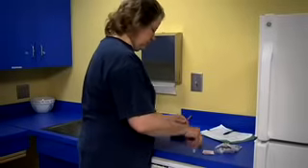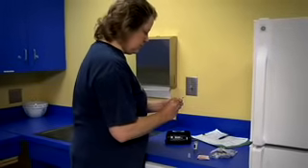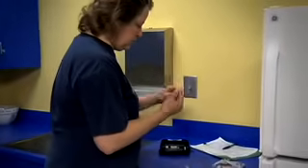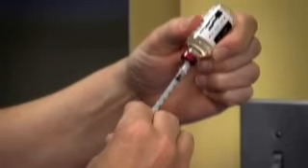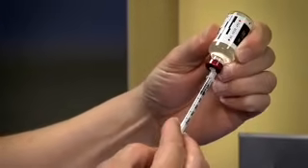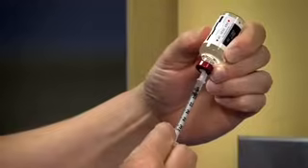Remove the cap from the needle. Pull back the syringe's plunger to the number of units of insulin you'll be taking — this will pull air into the syringe. Push the needle through the rubber top of the insulin bottle while it is on the flat surface. Push the plunger all the way down to push the air in the syringe into the bottle. This makes it easier to draw out the insulin. Keep the needle in the bottle and turn the bottle upside down.